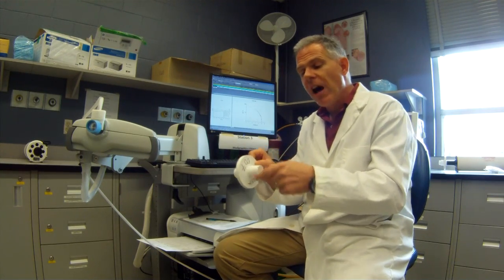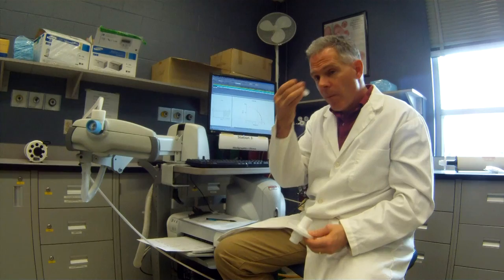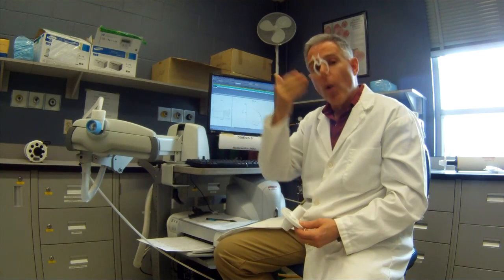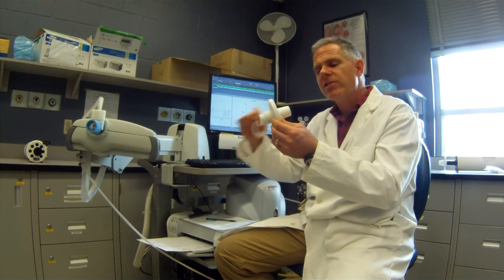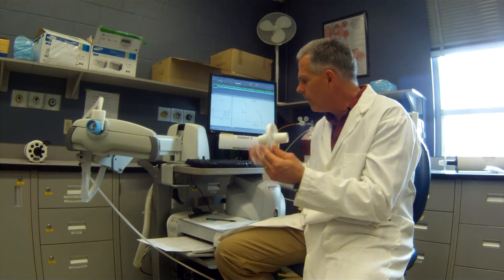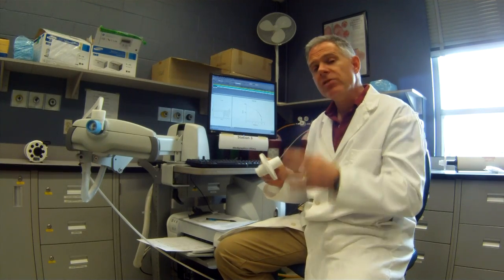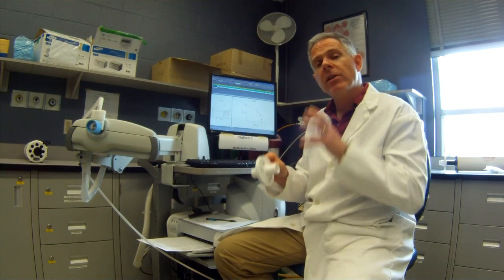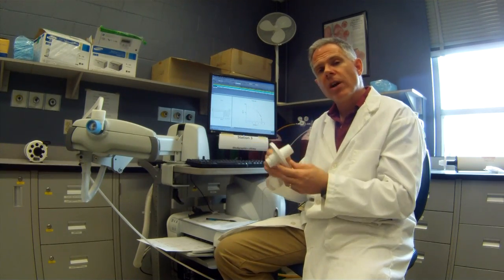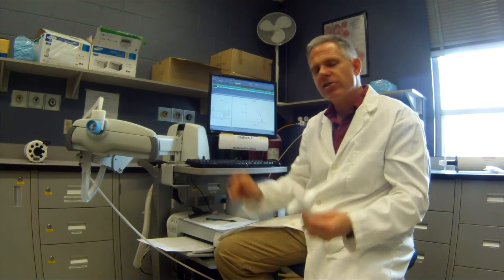Sometimes you can use other types of mouthpieces, like those scuba type mouthpieces, to make sure you get a good seal. Like always, we're going to have our patient wear the nose clips to make sure all the gas goes in and out through the machine. And we're going to be making sure that there's no leaks in our system. So it's a very easy test for the patient. They're going to basically put the mouthpiece in, no obstructions, and just nice, easy breathing. We just let them relax on the machine.